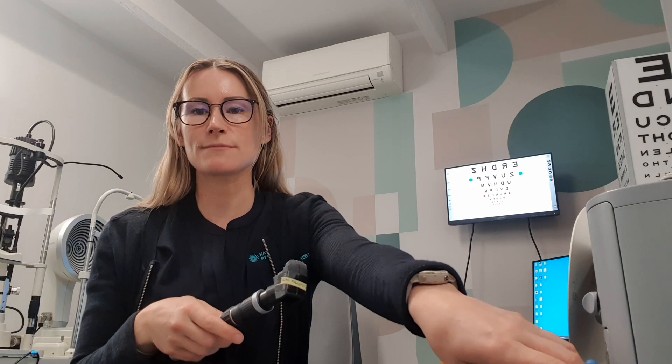One of those is a retinoscope. Using this in conjunction with the trial frame and the lens in the trial frame, we use this light to tell us whether the child is long-sighted or short-sighted, which can be quite handy with young children. Even in older children, kids can be very good at focusing over any prescription they have, and this allows us to see if there is an underlying prescription — perhaps they can still see really well in the distance, but it could be contributing to difficulty, with their eyes having to work harder when they look up close if they're long-sighted.